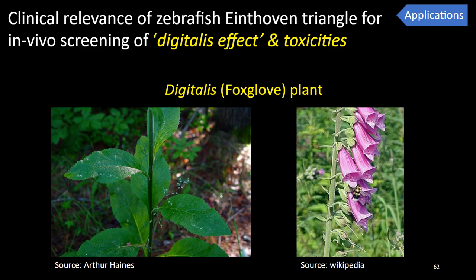Next, we will demonstrate an application of zebrafish Einthoven's triangle in in vivo drug screening using digitalis at low dose to recapitulate the human digitalis effect, which is defined as the earliest non-toxic ECG manifestation of adequate cardiac tissue absorption. Then we will use digitalis at high dose to recapitulate human digitalis cardiotoxicities.